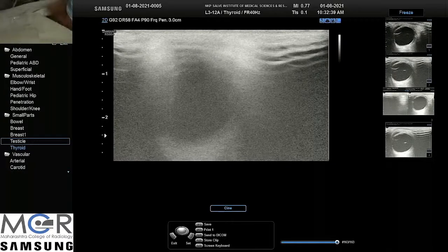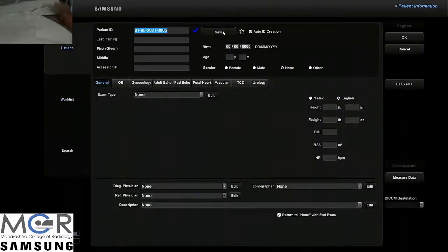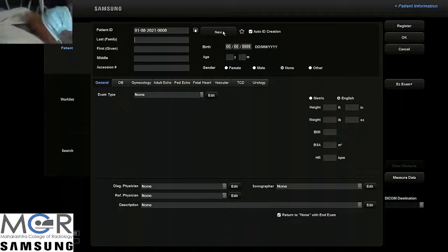The next patient has come. What is the history? Patient is a 60-year-old male who gave the history of diminution of vision in bilateral eyes since 7 years. Patient is an operated case of left eye cataract. Now the patient was diagnosed to be a case of cataract in the right eye, and patient is posted for cataract surgery. So this is pre-op evaluation.